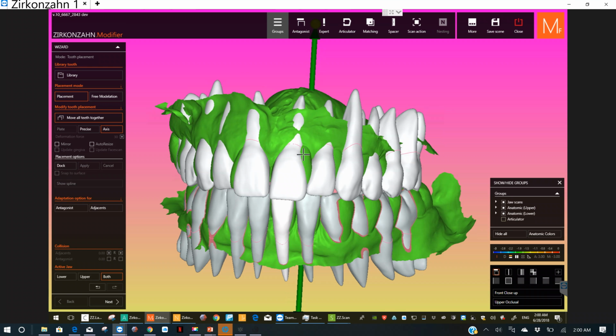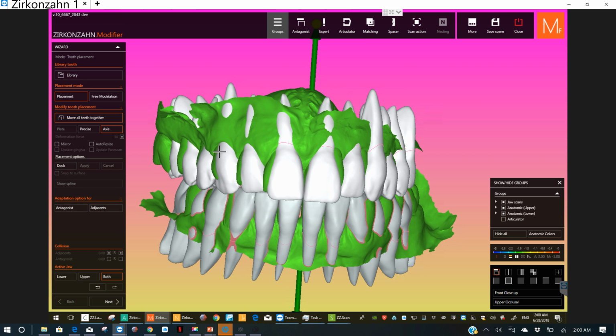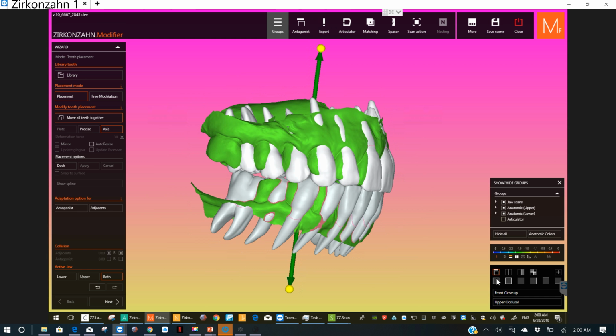I want my bridge to be perfect there. Shouldn't your try-in be perfect too? Don't get too caught up in blending this into the crappy gum line. Her gum line is all over the place. Leave the teeth where they are, and if it sticks out, let it stick out. Maybe I need to listen to my own advice. I'm going to maybe not move that so much.